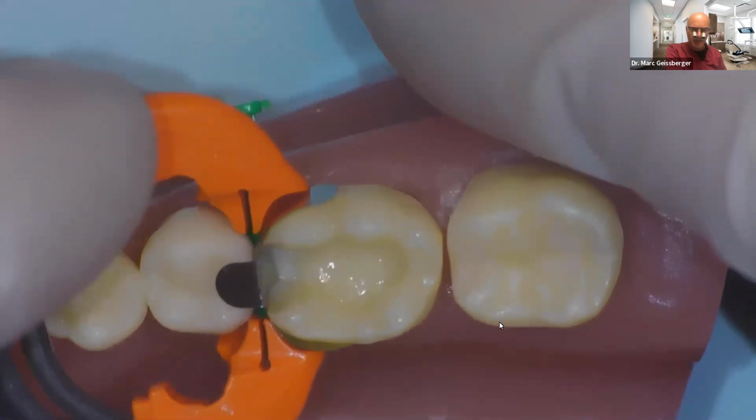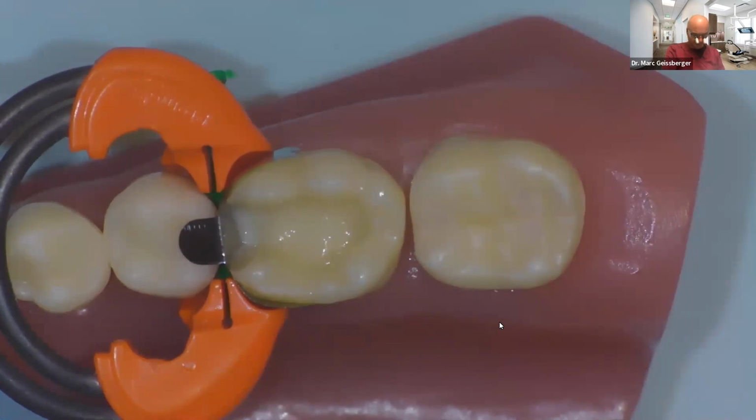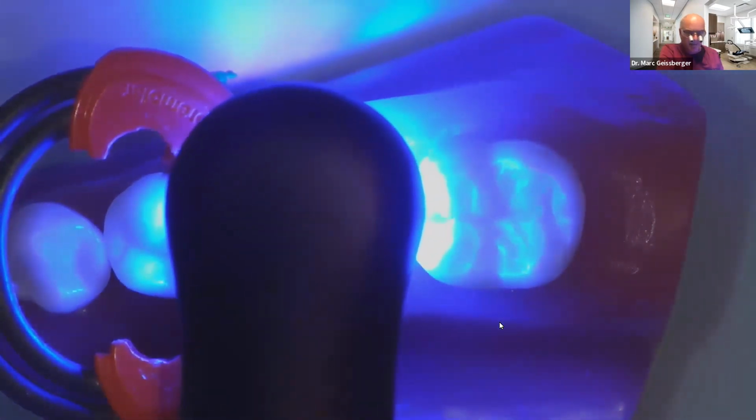Having a nice smooth base of flowable helps to seal your margins beautifully and really allows you to place your next layer quite efficiently. Now I'm going to grab my curing light and I'm going to go ahead and cure this. And I'm going to give that a full 10-second cure.